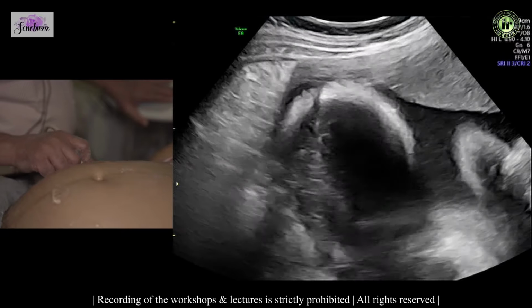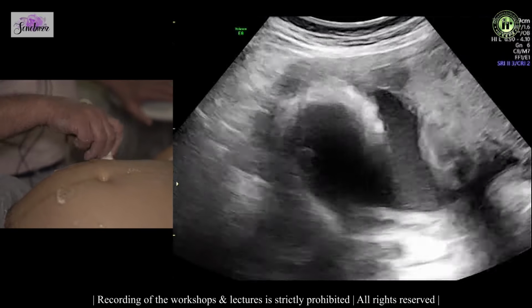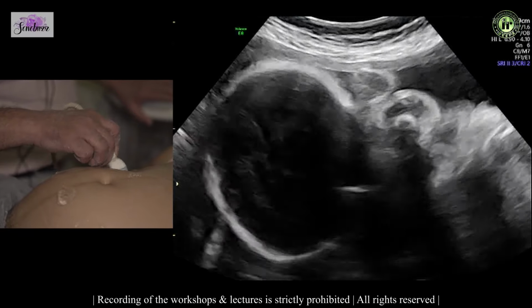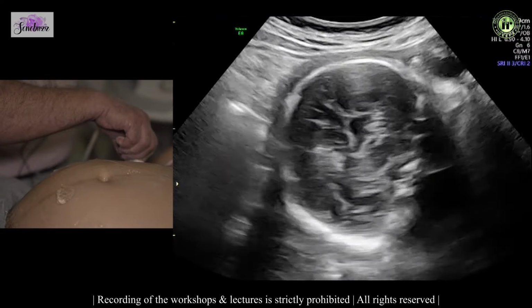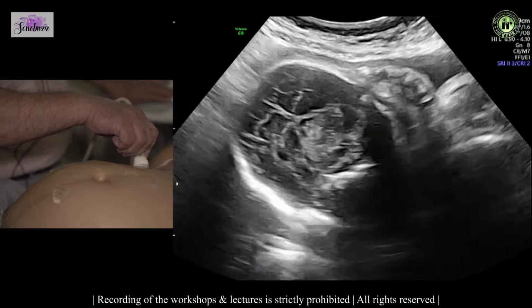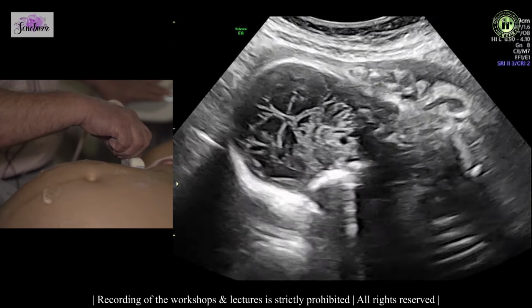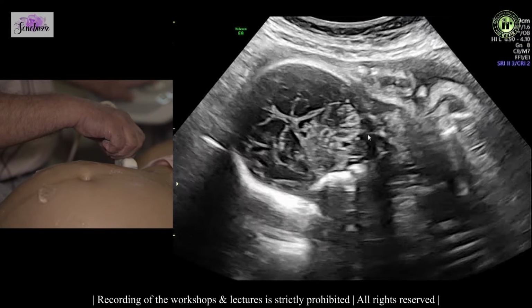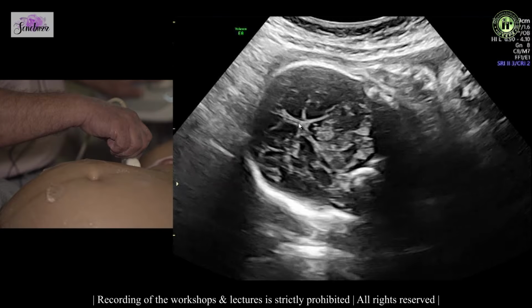And sometimes we can get a coronal and sagittal view. We'll just see if we can get a sagittal view. We have to manipulate the fetus a little bit. And that's the coronal view of the cerebellum. You can see the cerebellar folia, the tentorium, the sulcus here.